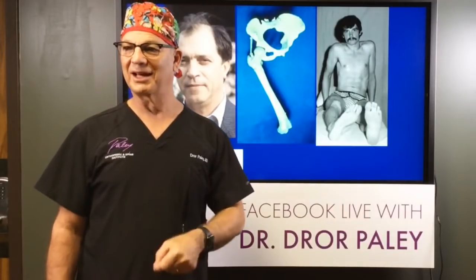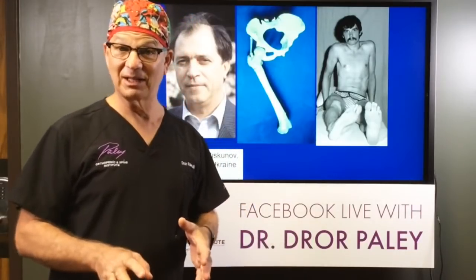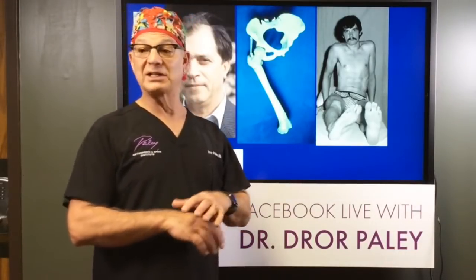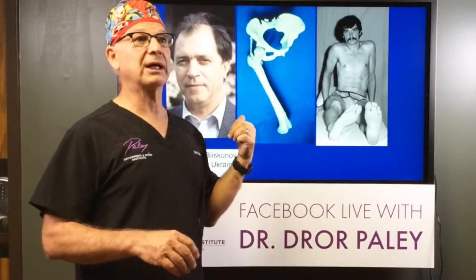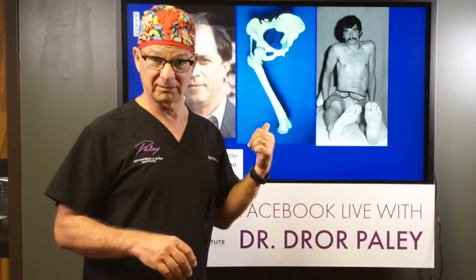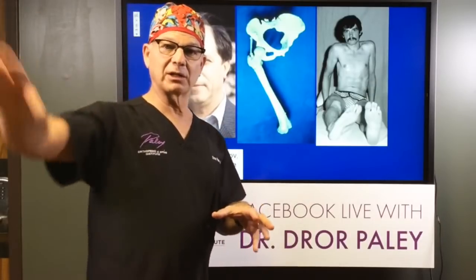The first commercial device in the West was this thing called the Albizzia nail. It came out of France. A medical student came up with it, Jean-Marc Guichet, a friend of mine. Similarly, the bone was broken, and he created something like a ratchet on the inside so that if you shook your leg a certain way, it would lengthen. The problem is, it was hard to control the rate.